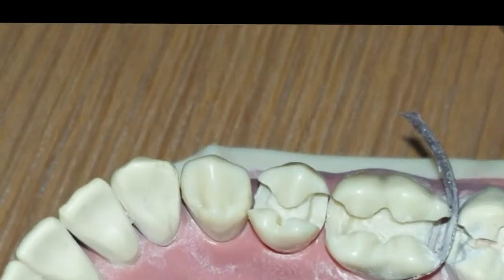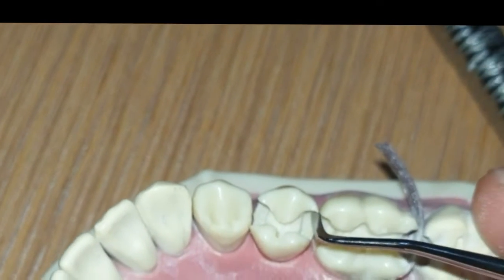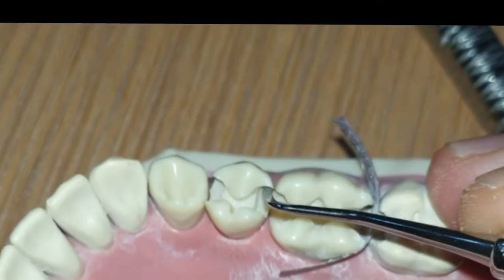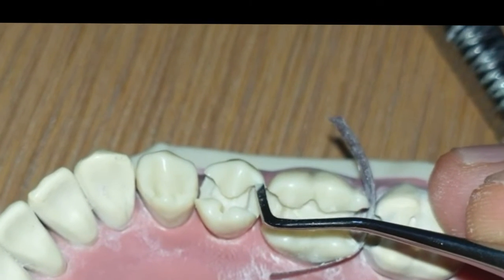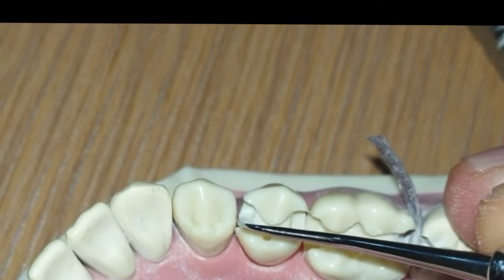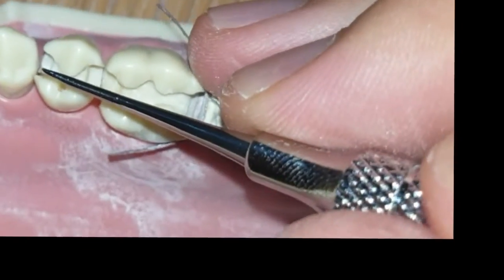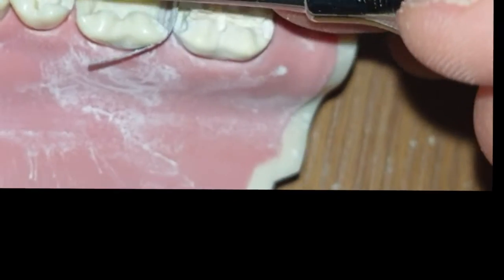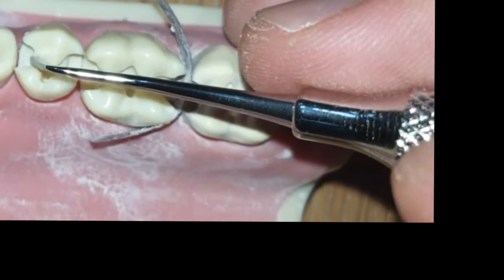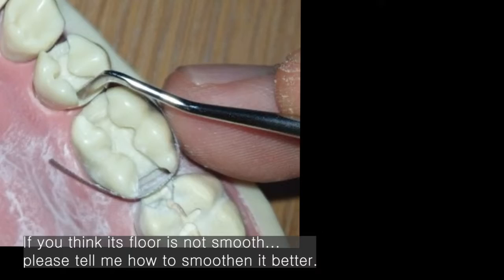But I was able to make it. Next time, my assignment is to find out how much proximal box contact release should be — whether it is okay to go this far or not. Next time I'll check once again to flatten the side; just one stroke makes it far more beautiful. But I couldn't see it because it was covered by the canine — it is my fault. The walls and floor are very, very smooth. I have improved my skills to flatten the floors very well. Thank god — very smooth, I like it.